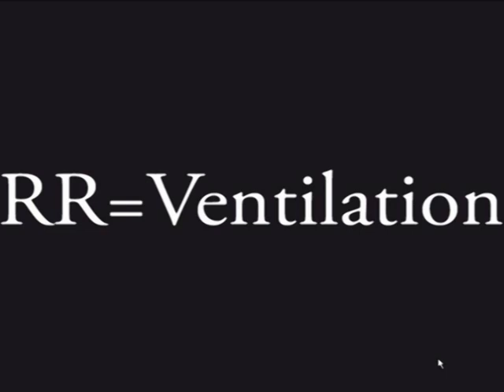Respiratory rate is how you change ventilation. If they're hyperventilating, you go down. If they're hypoventilating, you go up on your respiratory rate. That's it.